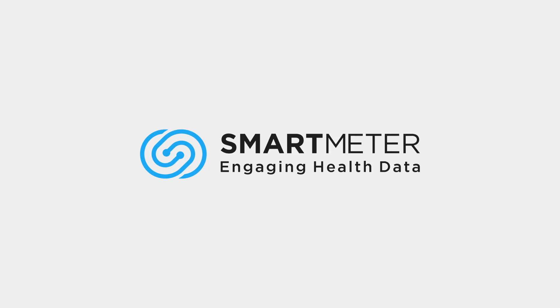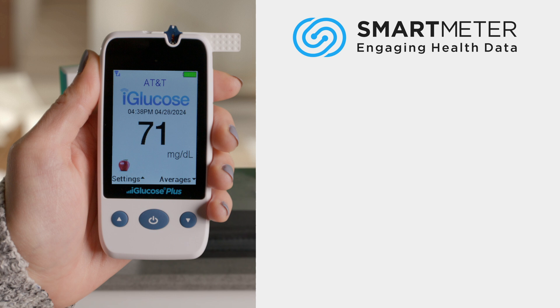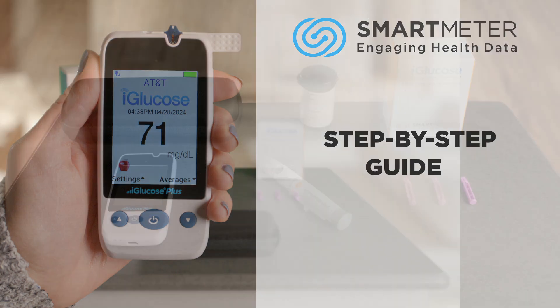Thank you for choosing the iGlucose Plus to help you manage your diabetes. Here's a step-by-step guide on how to use your meter for accurate and easy blood glucose monitoring.